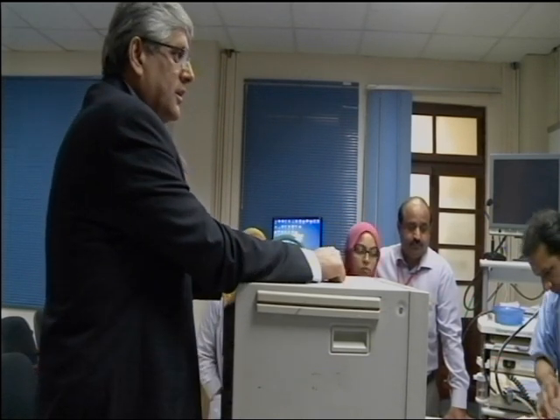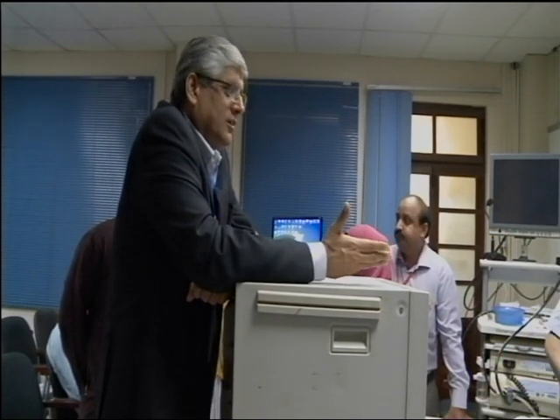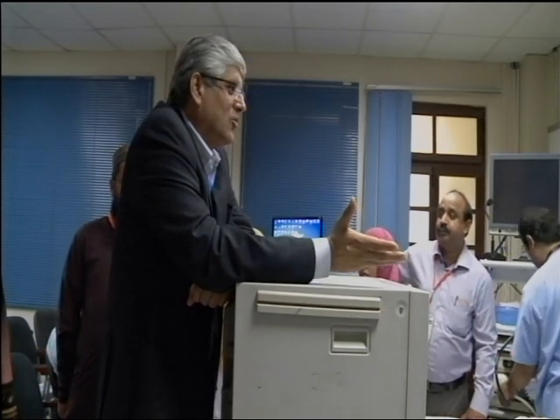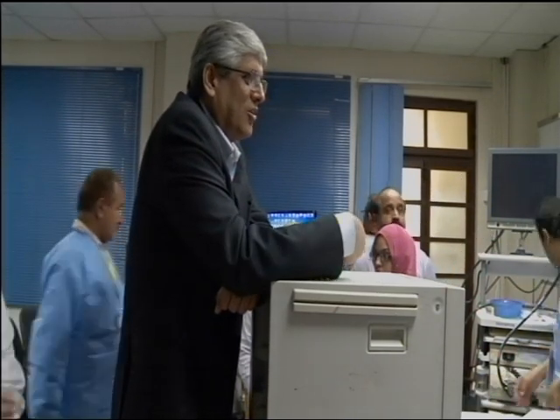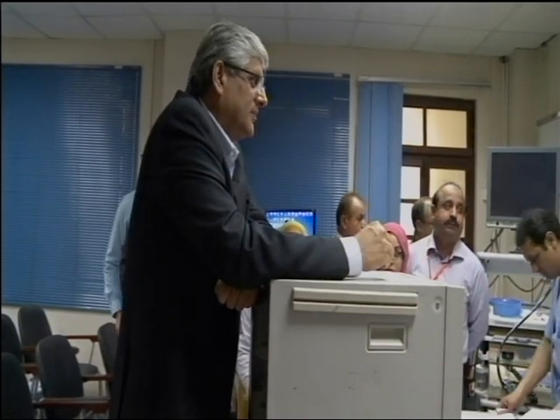Okay? So what is 1-to-1 movement? Yeah, 1-to-1 is very important. You know what 1-to-1 is, right? So 1-to-1 is very important because that tells you your scope is moving along with you. If you lose 1-to-1, you know you are creating a loop. What do you do when you create a loop? You have two options. Either anti-clock or you go clockwise. The smarter people will know how to get anti-clock the right way, and Paul might have explained it to you. Someone like me, I'm not bothered. So clockwise is useful. It doesn't delay anything. Don't worry too much about the configuration of loops.